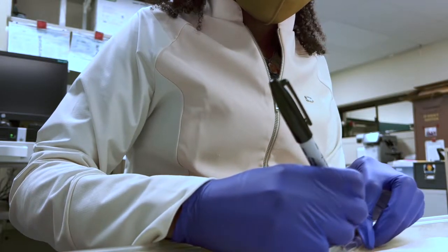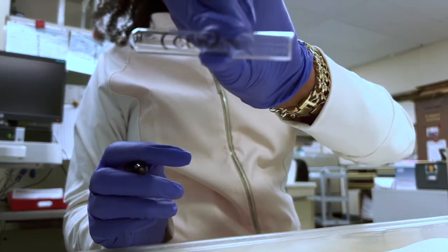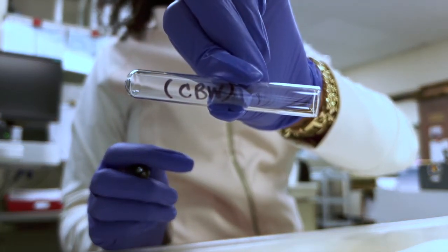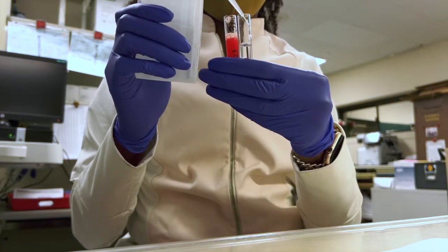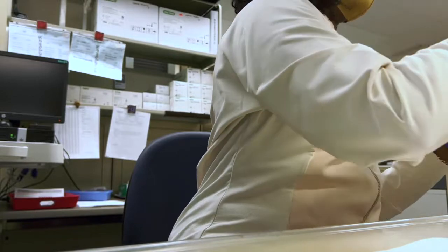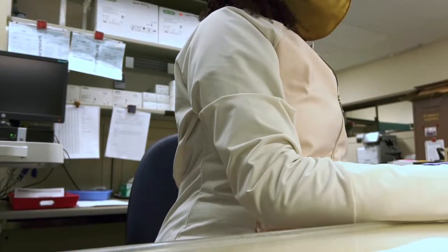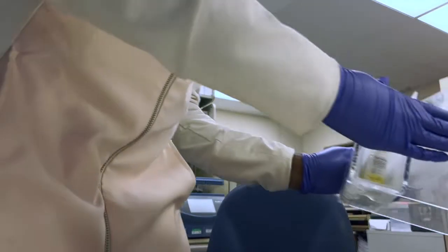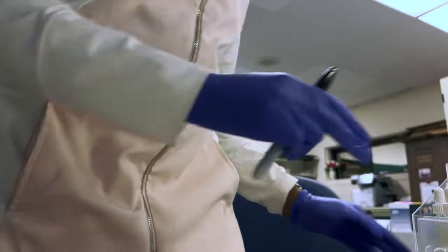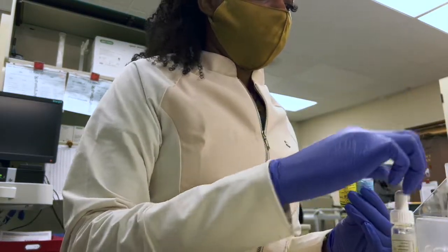Back over in blood bank, I got a cord blood workup. That's what CBW stands for. Here I'm just washing the red cells to remove the Wharton's jelly that can cause false agglutination. Getting my reagents out of the refrigerator, and we're just going to do the forward type and perform a DAT.